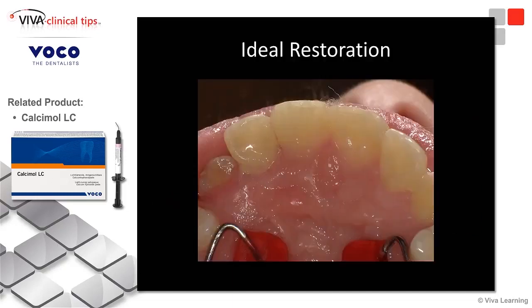Wedge in place, and there's our restoration when it's totally said and done. You can see A2 Admira Fusion truly blends.